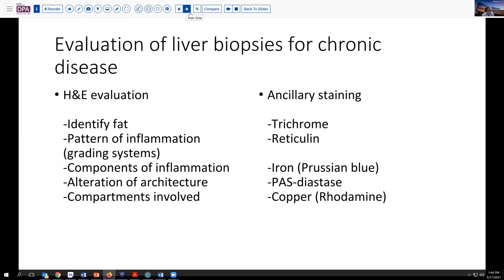Because of those things on that list that are of significance, but maybe not always clinically evident or distinguishable by routinely managed blood tests and liver function testing, many times these patients come for a biopsy to evaluate the possible etiology and to provide staging and predict response to treatment. So with routine H&E, we can identify fat, we can discern the pattern of inflammation. We can also see what kind of inflammation is present, whether they're plasma cells, lymphocytes, eosinophils, neutrophils, and so forth. We can usually discern the alterations of architecture that may be present and define which compartments of the liver anatomy are involved.